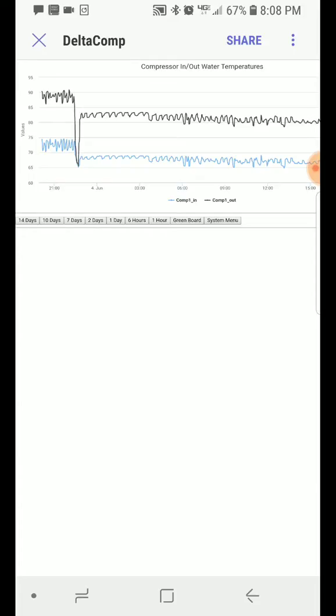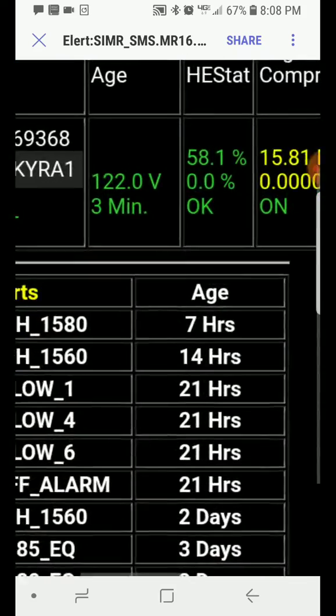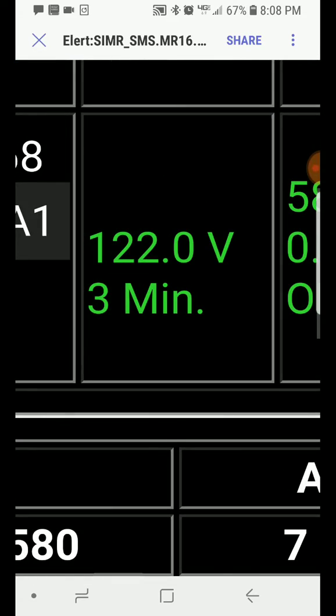Okay, so now let me show you what you should be looking closely at when this happens. You want to evaluate, did I lose 480 power? Did I lose 110 power? So I'm going to take you into how to evaluate that. So this is where 110 power is represented.